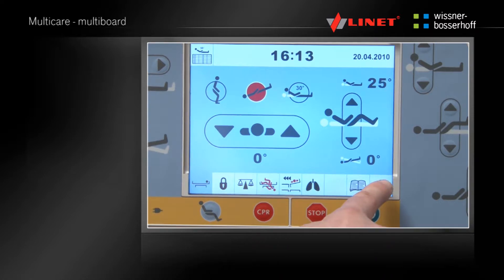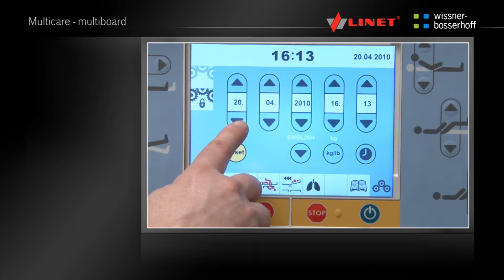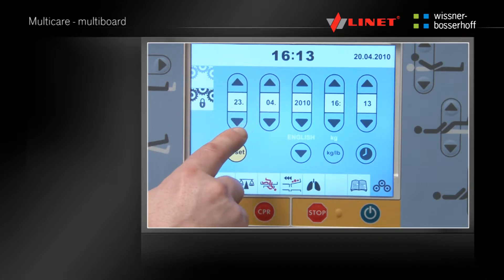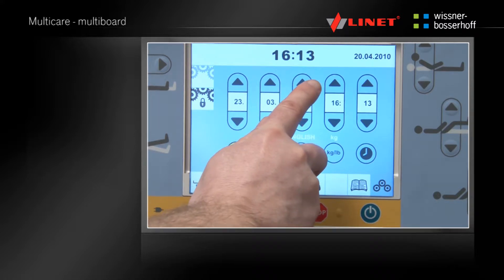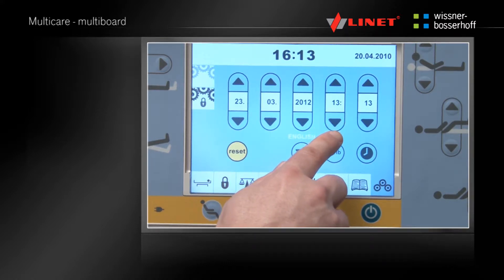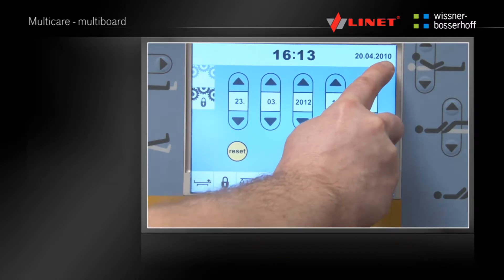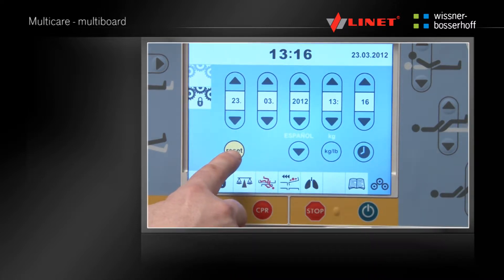By pressing the next icon, the basic settings menu is displayed where the date, time, menu language and weight units can easily be changed. By pressing the reset icon, the bed settings are returned to the factory default settings.